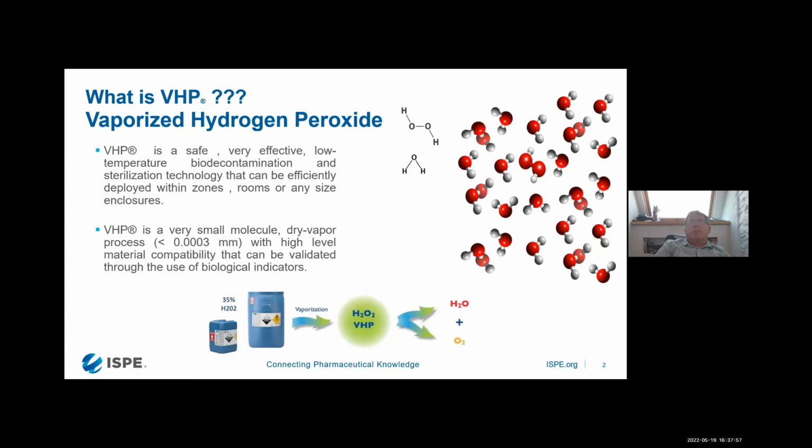So some countries accept the word sterilization, some just accept the word biodecontamination because at the end of the day, it's just a surface decontamination. So only the exposed surface would be decontaminated.